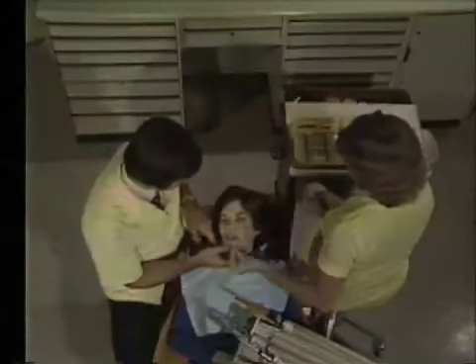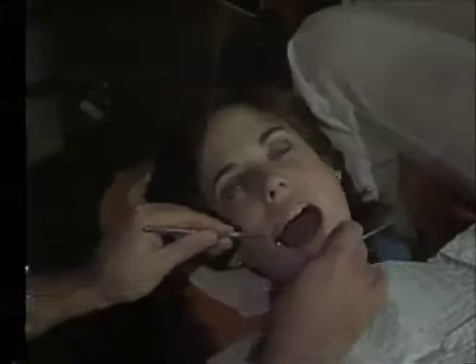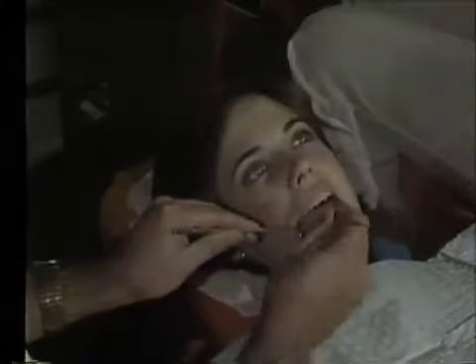When utilizing the 9 o'clock position, the operator's legs form a V around the back corner of the patient's chair. The operator sits as close as possible to the patient and centers the area to be treated over the lap. When utilizing the 7 o'clock position, the operator sits with legs parallel to the patient's chair. The patient's head is turned toward or away from the operator as needed to improve access and visibility.